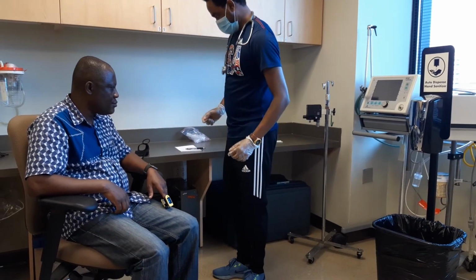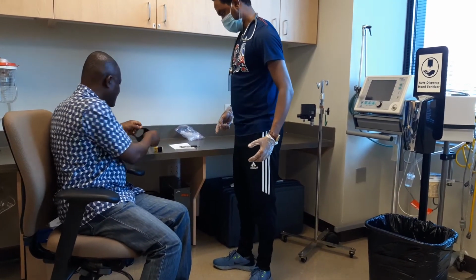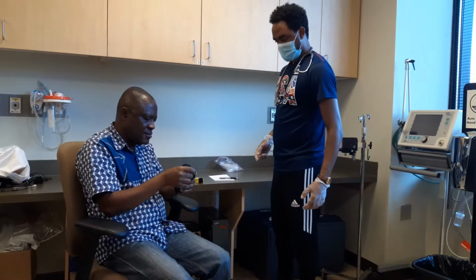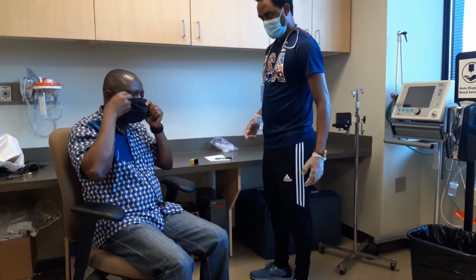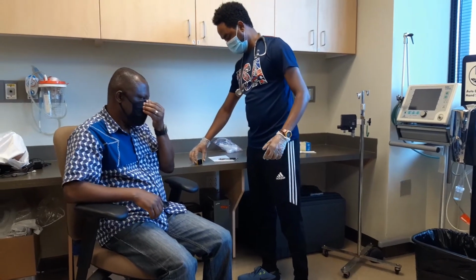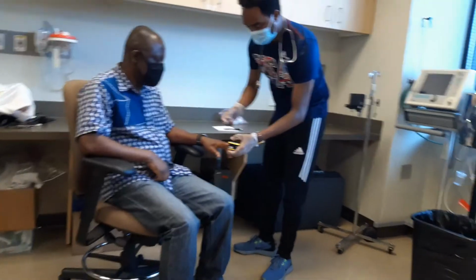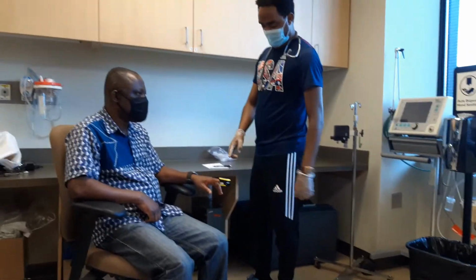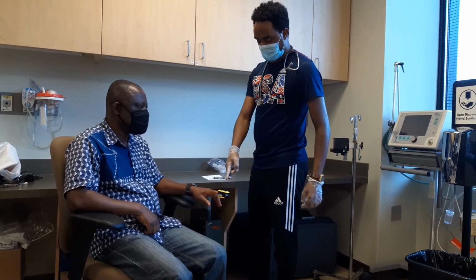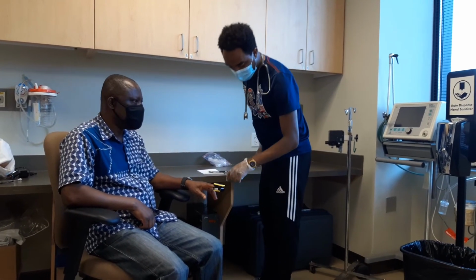All right, you can close your mouth, mask. I'm going to assess you again, your pulse oximetry and heart rate, because I already got the manual heart rate, so I'm just going to check your heart rate from the pulse oximeter.